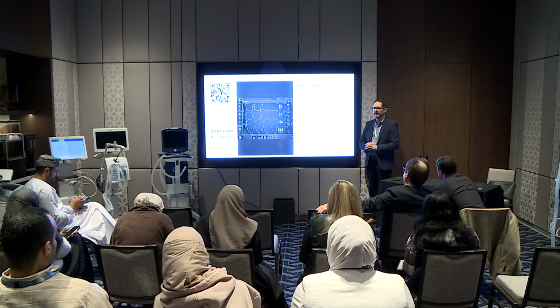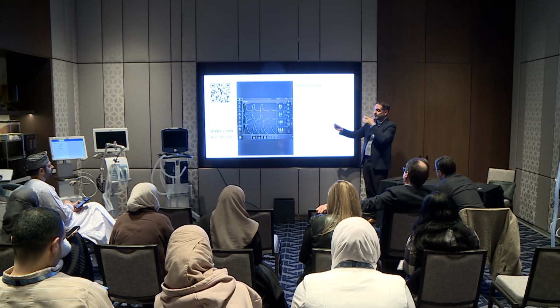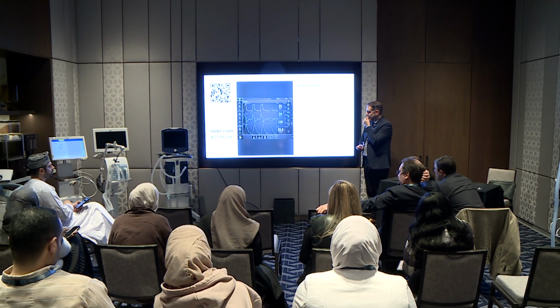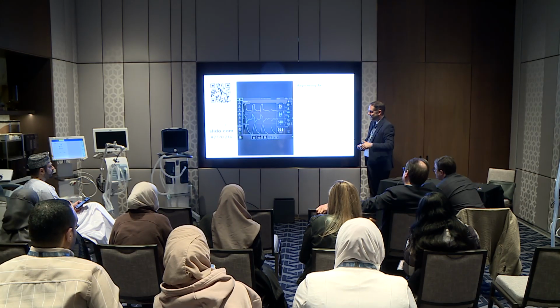So let's walk it through as well. So some people are voting very quickly. Are they triggering the ventilator? Like, is there evidence of a trigger? Yes, they're definitely triggering the ventilator. So we know it's not reverse triggering. We'll go with that.